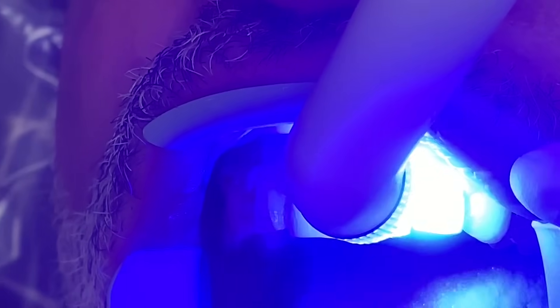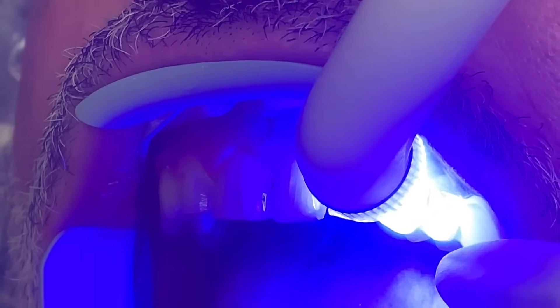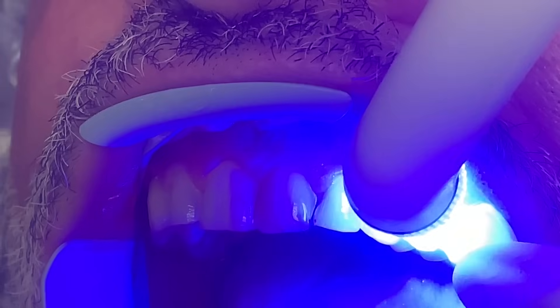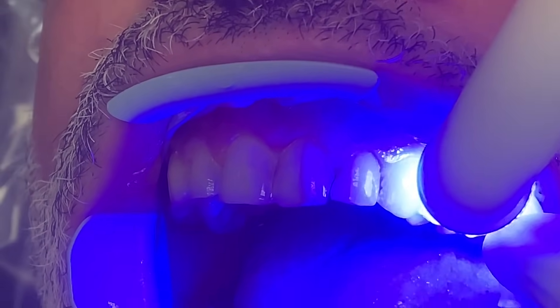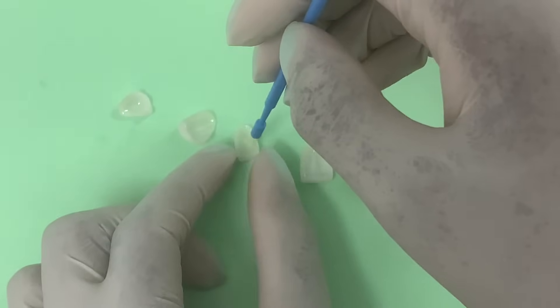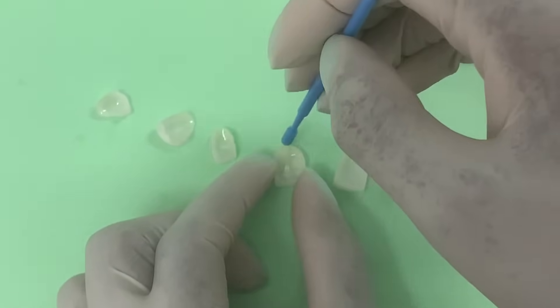The veneers are only going to wrap over the edge of the tooth — they do not cover the inside, they strictly cover the outside and wrap over. There are a lot of different types of cements we can use, but we're going to use a light cement. It's a bleach shade because he wanted lighter teeth — everybody wants lighter teeth. So once we get through with this, we'll start to seat the veneers one by one. The assistant will paint a layer of bonding on the inside of the veneer, which prepares the veneer surface.